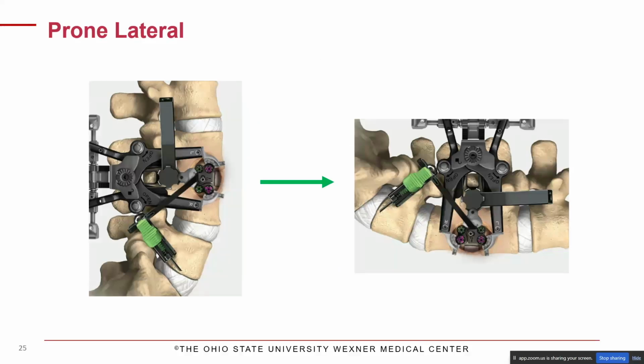And then again, the rest of the case is the same. You just have a different perspective. So instead of looking at it in this orientation, you're looking at it in this orientation with the table-mounted retractor facing posteriorly.